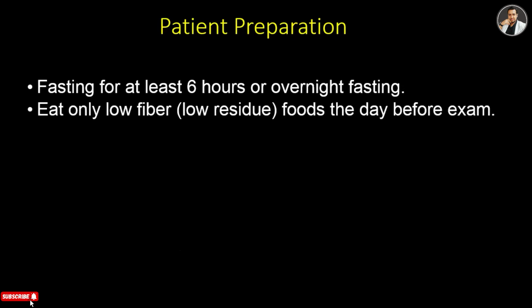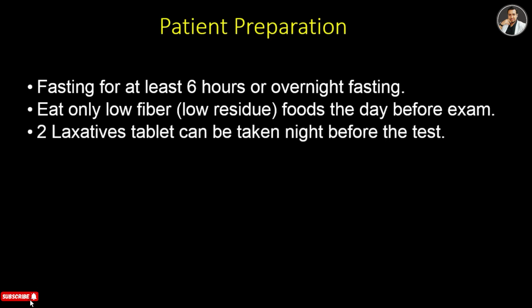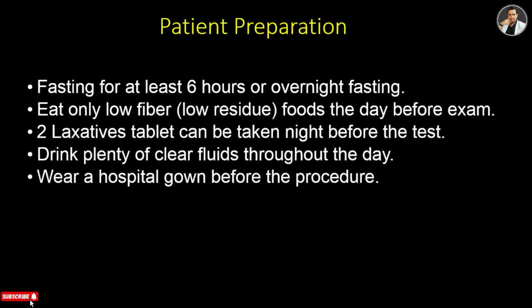Before the day of the exam, the patient should only eat a low fiber or low residue diet that digests quickly, and two laxative tablets can be taken the night before. Laxative tablets help to clear the bowel quickly, and the patient should drink plenty of clear fluids throughout the day. And in the hospital, before the procedure, the patient will wear a hospital gown.